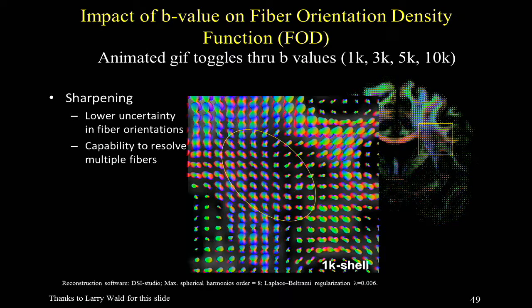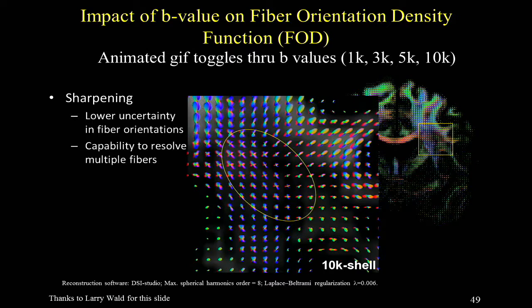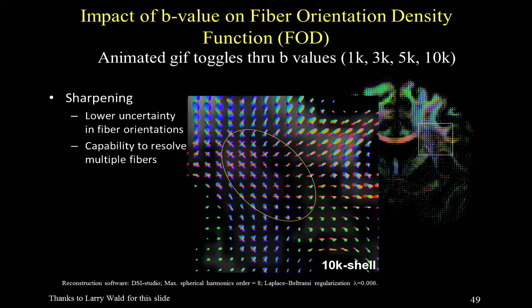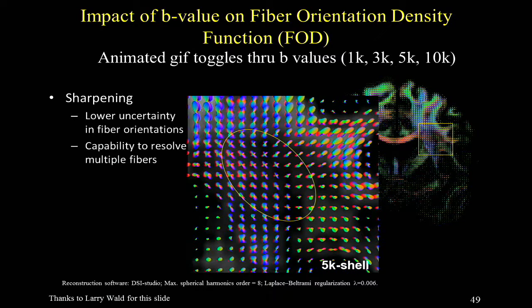And the problem with diffusion tractography is that it's a terribly ill-posed problem. I can take a single wrong step due to noise, and now I'm on 95, and I think I'm headed to the GW Bridge, but instead I've gone on 95 North. I missed the Cross Bronx, and I wind up in New Haven, right? So a single wrong step can doom you, and can doom you in massive ways. You can have great data with a single point of noise, but the stuff that you get out of it is completely and utterly wrong.